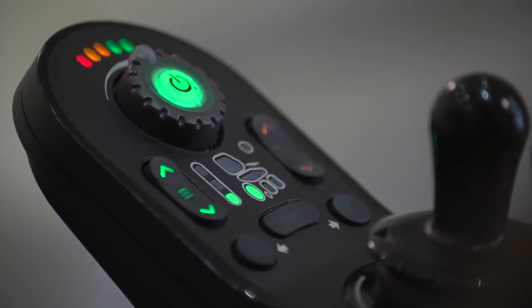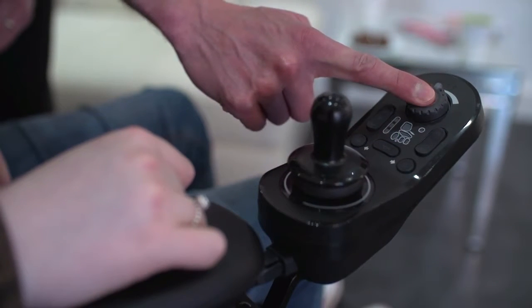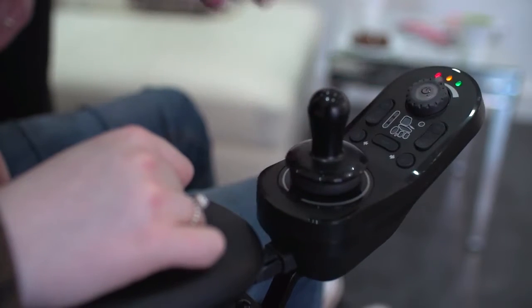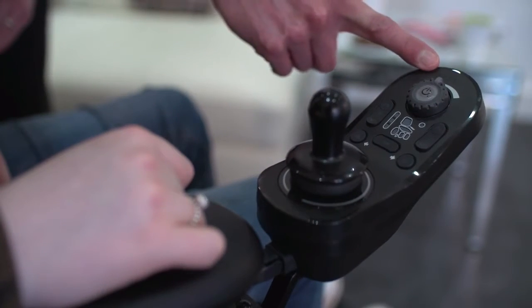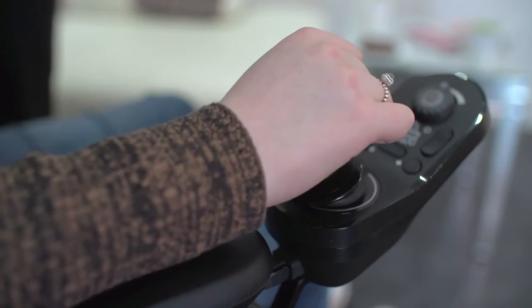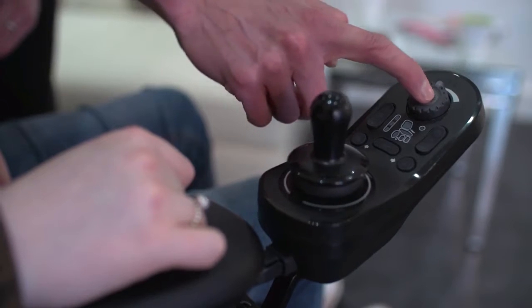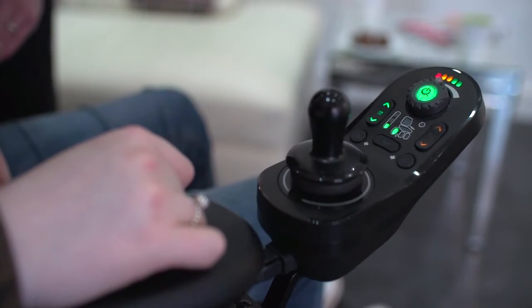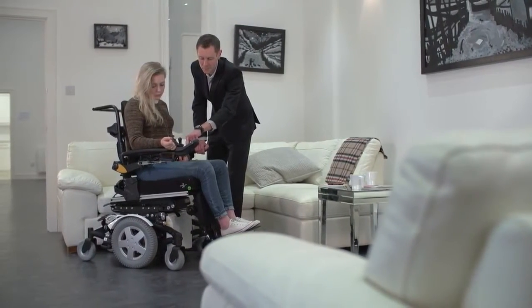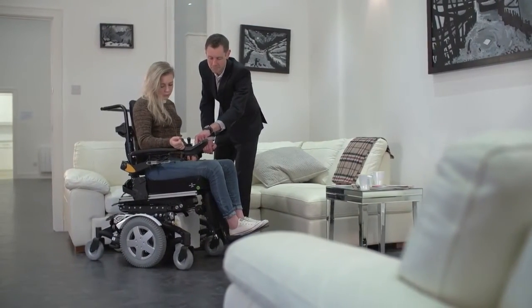The keyless lock function can be activated by holding the on-off button for over 4 seconds. The left, centre and right battery LED will flash to show the power chair is in lock mode and the joystick will not operate. To unlock, simply turn on the remote and press the horn button twice within 10 seconds. This is a programmable feature so can be disabled by the power chair provider to suit the needs of the user.